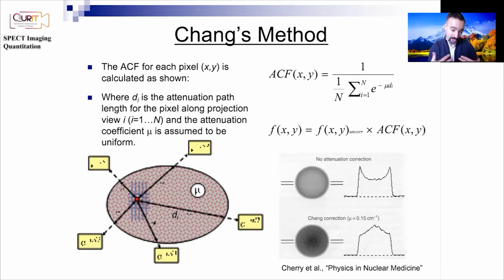That doesn't mean you should not be doing attenuation correction. That means now you have to move to the next iteration and correct for scatter. So just remember that point. First you correct attenuation, then the new problem shows up, just like in life. When we solve one thing, the other thing shows up, and now we're going to tackle that. But that was the idea.